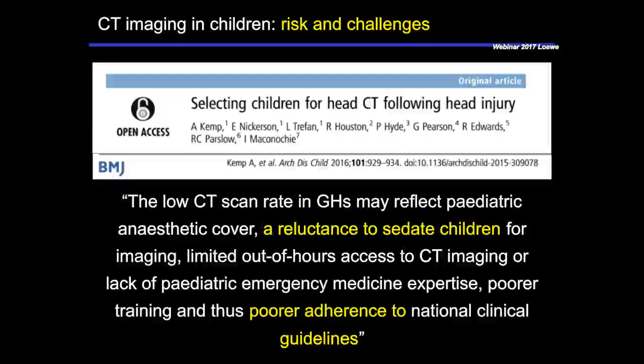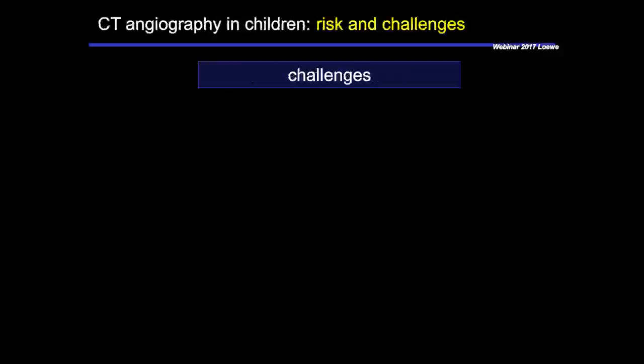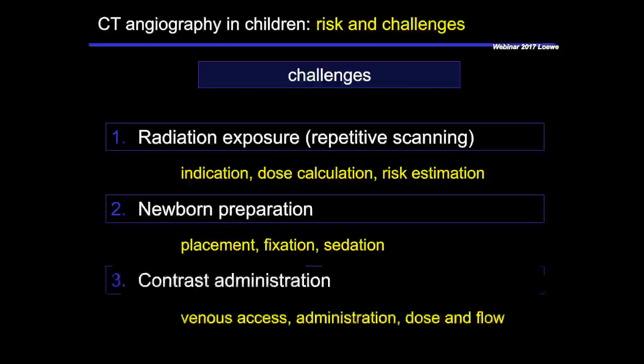So sometimes there is really a reluctance, and sometimes this leads to a delayed diagnosis in very small children. And this underuse of CT is, from a clinical perspective, not perfect. The specific risks and challenges are manifold, including the radiation exposure, the preparation of the newborn, placement, fixation, sedation, and the questions about contrast administration: the venous access, the dose, and the flow. What about the radiation exposure?